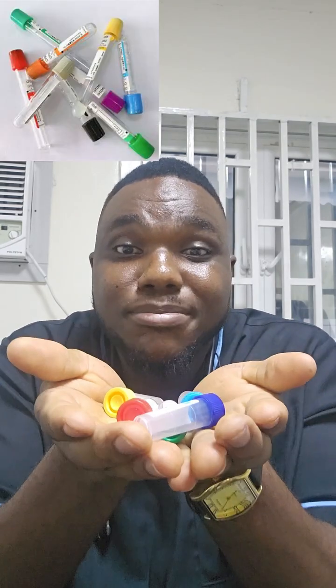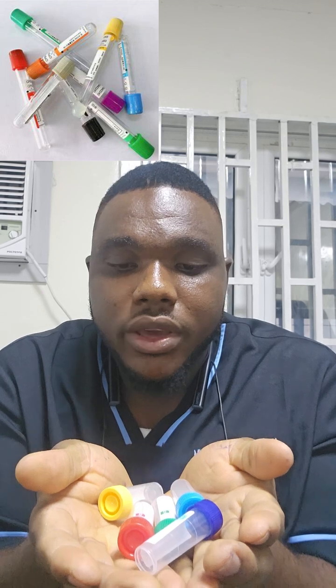The vacutainers also work with the same principle I just explained with these sample containers. So if for example you see the vacutainer of EDTA, most times they have this lavender color, or what we call purple coloration. It's a longer tube, but the mechanism of action is the same as with every other sample container I've spoken about.